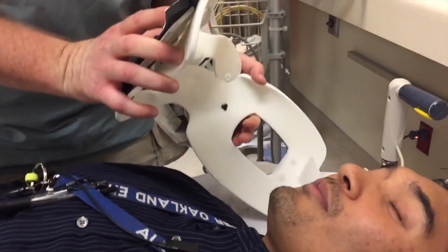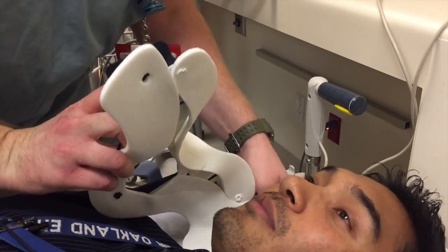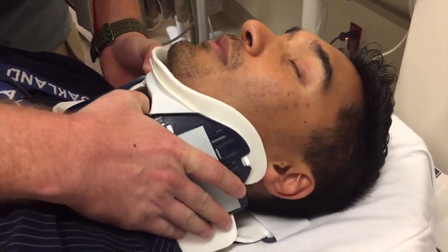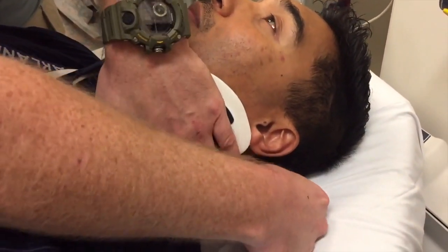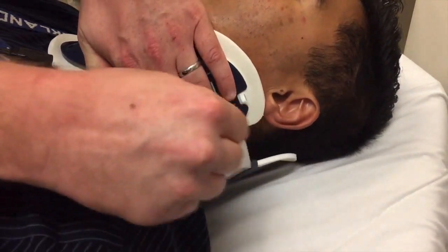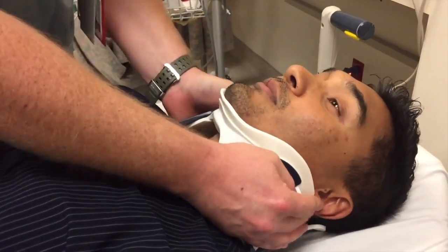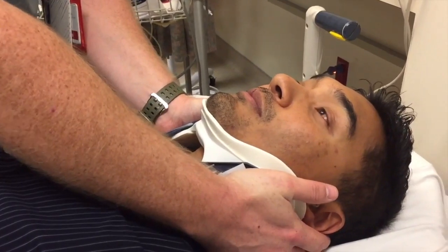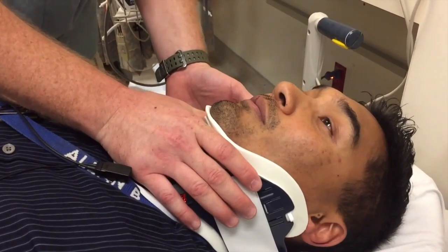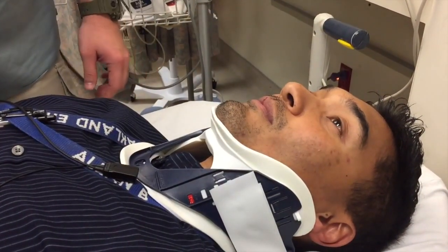First you want to feed it through. Keep in mind someone is holding his neck and bracing it, and then you just come around like so. Careful not to manipulate the neck. Tighten up there. Kind of look at the ears — sometimes the ears can be awkwardly sticking out or be painful. But then there you have it: feed it under, put it around his chin and neck area, secure it, and C-spine is established.